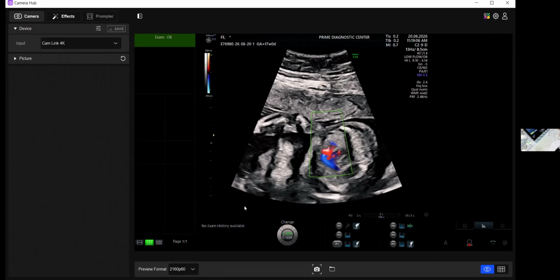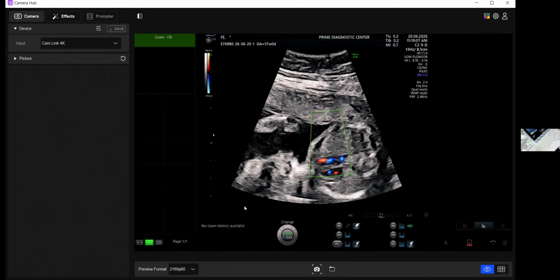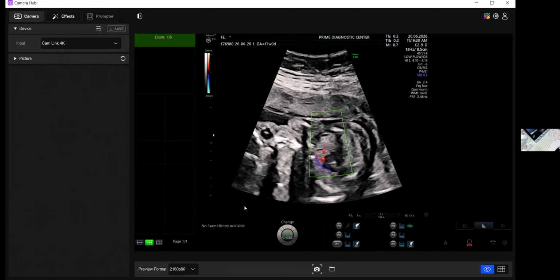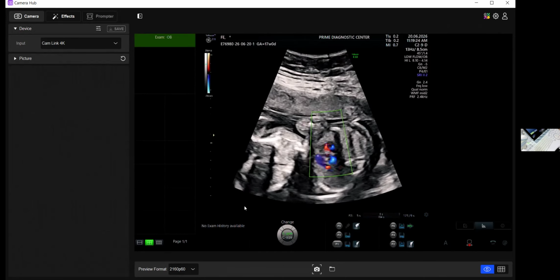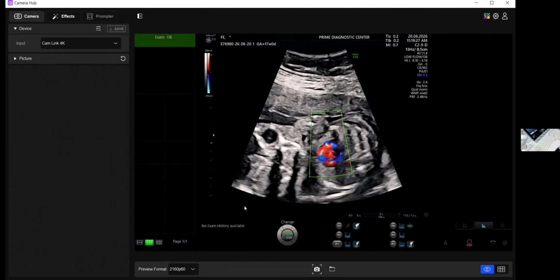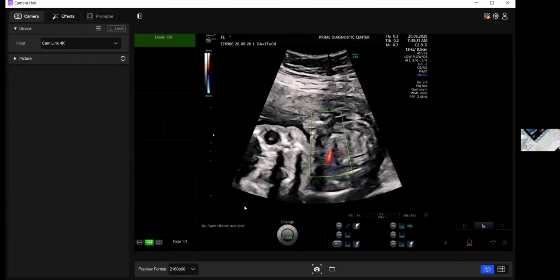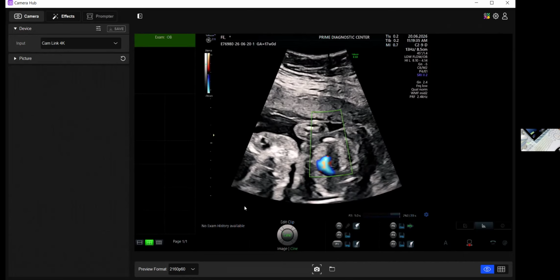Yeah, see, you see this mammary artery here, okay? And then the other one you saw here, and in between is the area of the thymus. So this is what they call the thymic box, and there's a nomogram available for the volume of the thymic box, but it has somehow not become very popular. We still follow the thymus measurement because we just need a rough assessment of that. Okay, beta, normal.